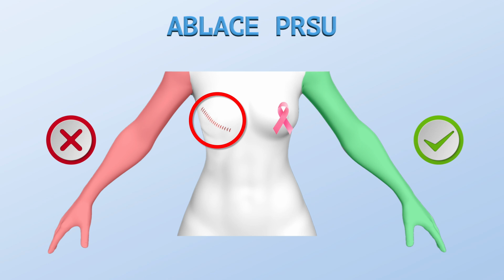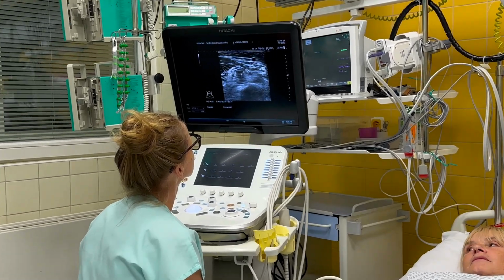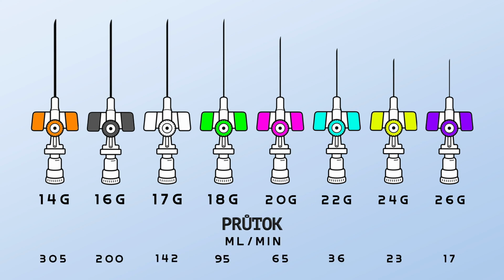To ensure venous access for such high-risk patients, the most experienced healthcare professional should be consulted, and if possible, insertion should be done under ultrasound guidance, or alternative vascular access should be considered. The size of the catheter is chosen based on the type, amount, and speed of the solution to be administered, taking into account the peripheral venous conditions.